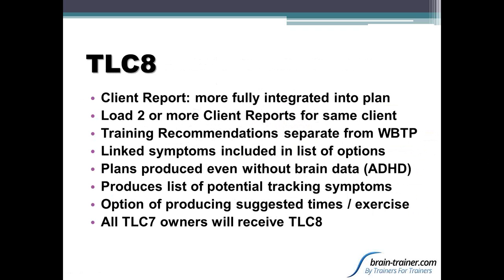And the TLC8 will also produce for you a list based on the client report of tracking symptoms, so that one of our approaches that's different to brain training is that I always tell people, if you have to do an assessment before and an assessment after to decide whether the training worked or not, it didn't work.